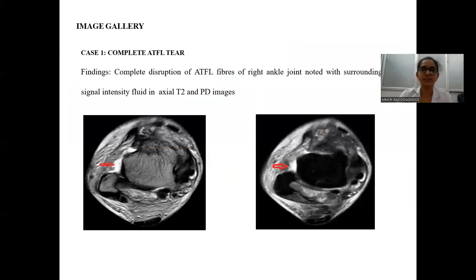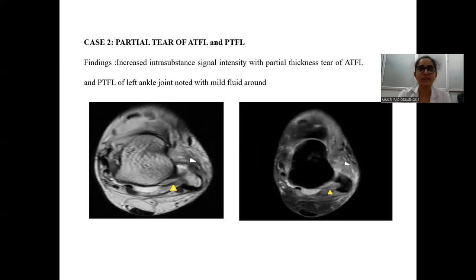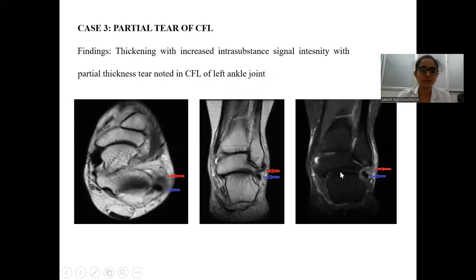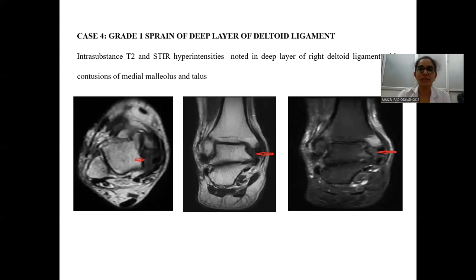Coming to the image gallery: this case shows a complete anterior talofibular ligament tear with complete disruption of the anterior talofibular fibers of the right ankle joint with surrounding signal intensity changes, seen on T2 and PD images. The next case shows a partial tear of the anterior talofibular and posterior talofibular ligaments with increased signal intensities and partial thickness tear of both ligaments of the left ankle with mild fluid. This is followed by a partial tear of the calcaneofibular ligament showing thickening and increased signal intensity. A Grade 1 strain of the deep layer of the deltoid ligament shows intersubstance T2 hyperintensity in the deep layer of the right deltoid ligament, with associated bone contusion of the medial malleolus and talus.